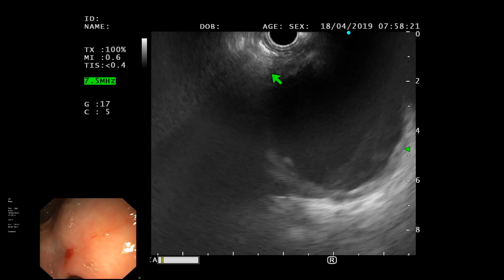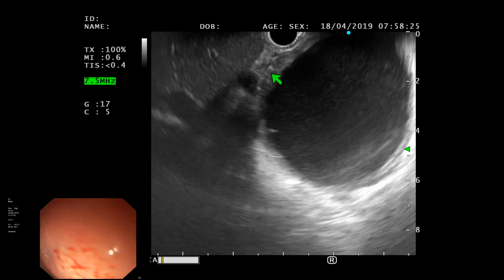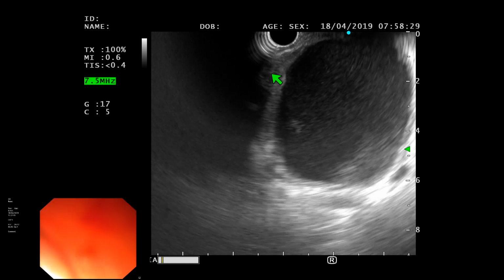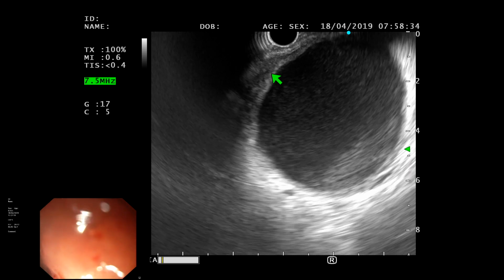Let me go back in there. I think we may not be able to examine those structures very well because it's all covered up by the cyst. Here I won't be able to see that. I think the cyst is involving, it's very nicely walled off.